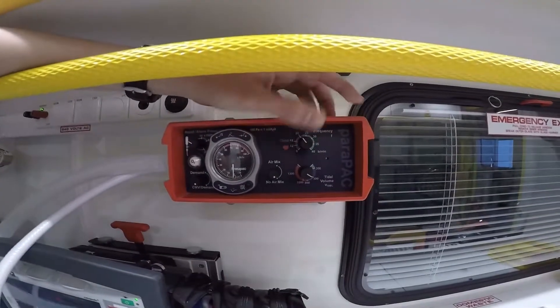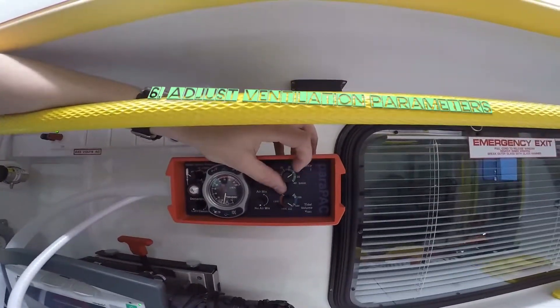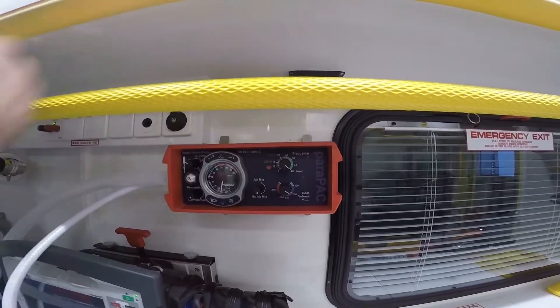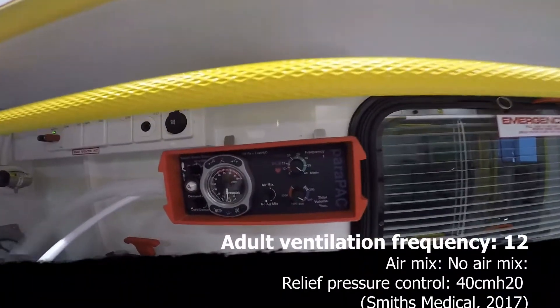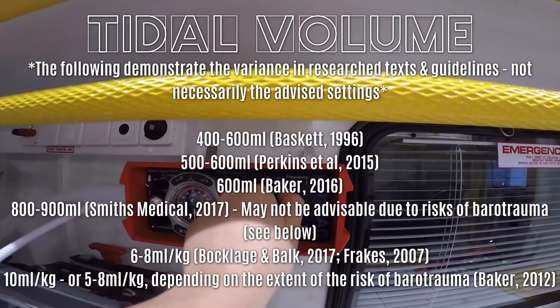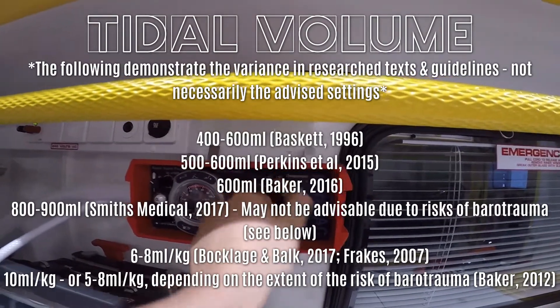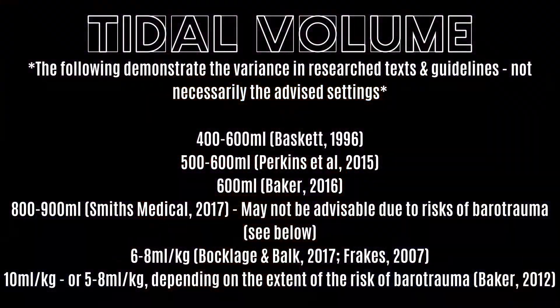Next on the list, adjust the ventilation parameters. Set the air mix control to no air mix for respiratory arrest or CPR. Set the relief pressure control to 40. Set the respiratory rate to 12. As for the tidal volume, it varies massively. It depends on whether you opt for an average value or base it on the patient's weight. Smith's Medical advise 800 to 900 millilitres on their training video. Don't worry too much about slight differences in tidal volume because the new pack features a high pressure alarm that we'll discuss shortly — the alarm will help you identify if the tidal volume is too high for your patient.